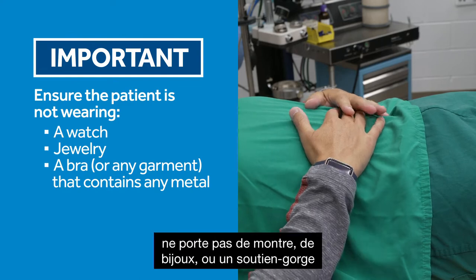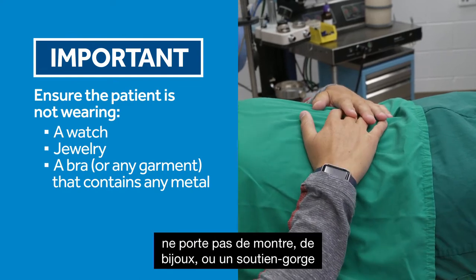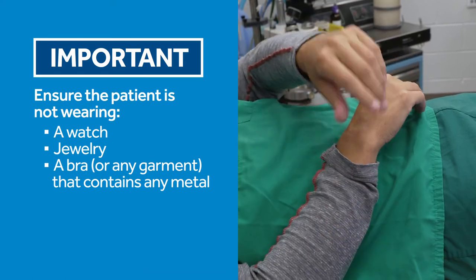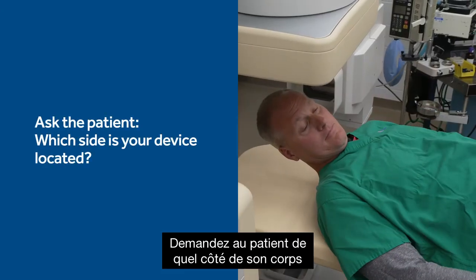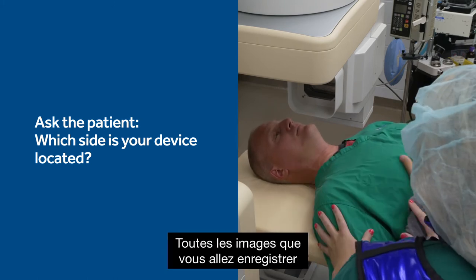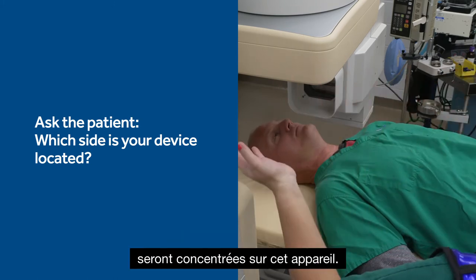Please confirm that the patient is not wearing a watch, jewelry, a bra, or any other garment that contains metal. Ask the patient which side of their body their cardiac device is located. All of the imagery you will be recording today will be focused on that device.